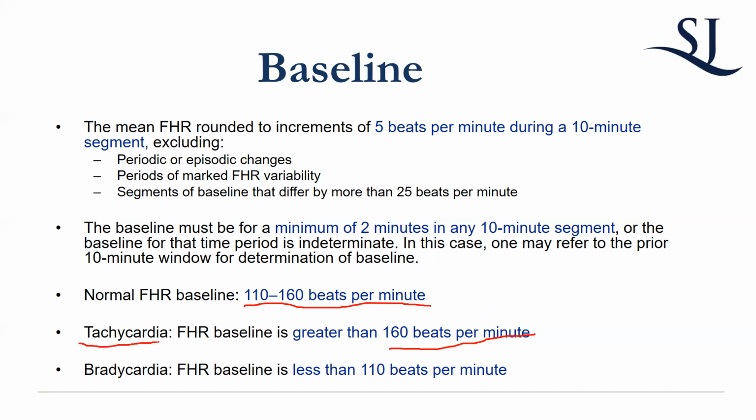But other reasons why sometimes when mom's very dehydrated and she's tachycardic, baby becomes tachycardic, okay? Or pretty much any other reason that's going to make mom tachycardic systemically will make baby tachycardic as well. If she just has a high baseline heart rate, which a lot of patients actually have, baby won't be tachycardic. That's just mom's baseline.